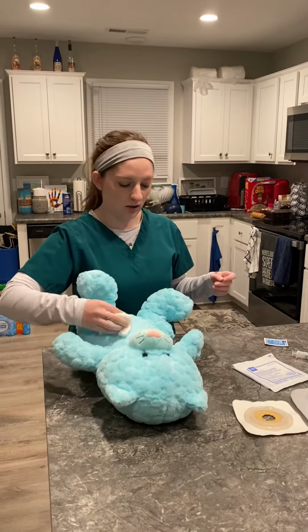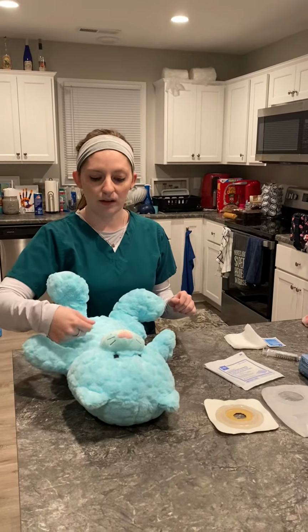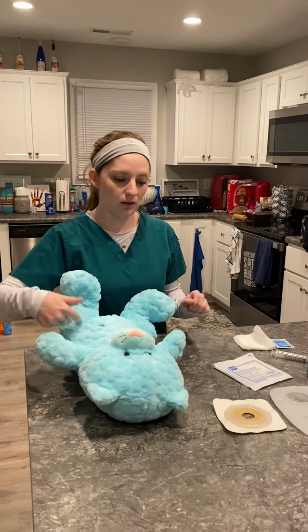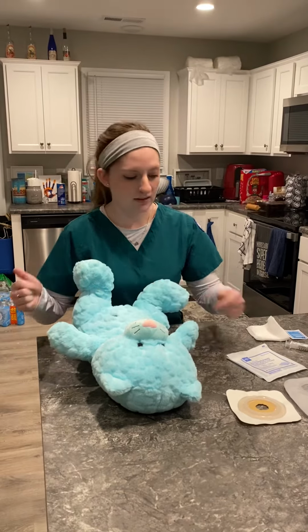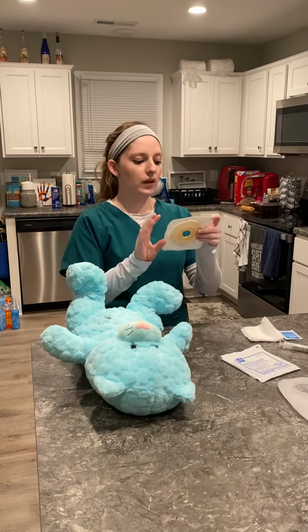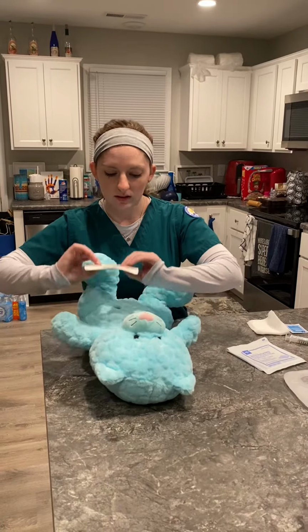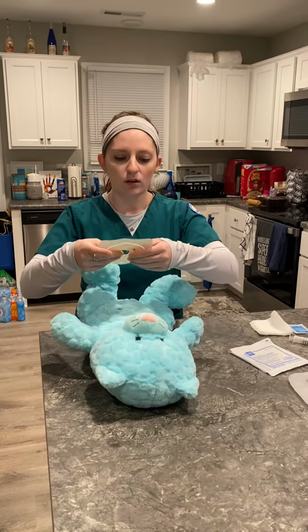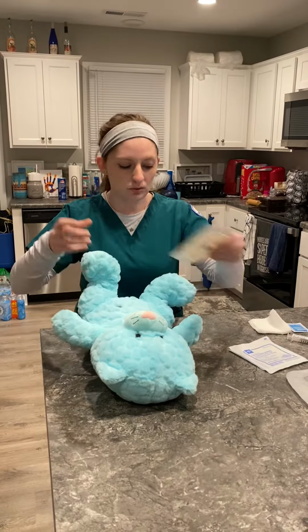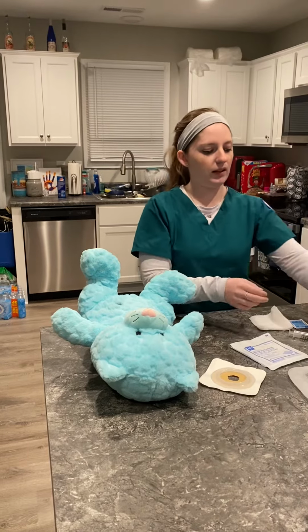So now that the stoma is completely clean, you can also use a barrier when applying the ostomy to help stick the wafer. But you will measure the stoma, and I've already cut out my hole to fit my patient's stoma. So I'm going to apply my gloves. I've washed my hands.